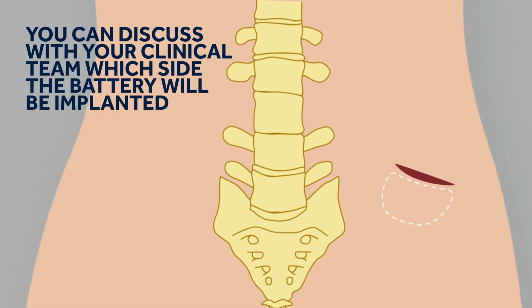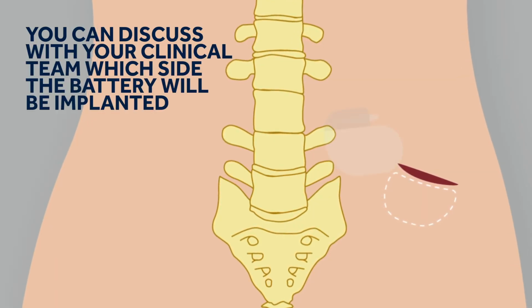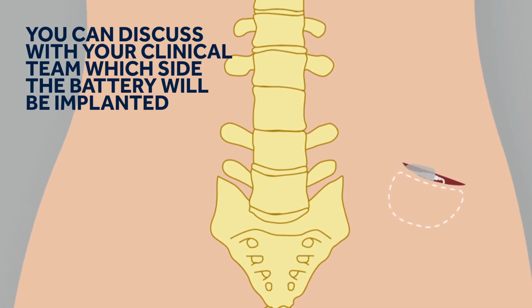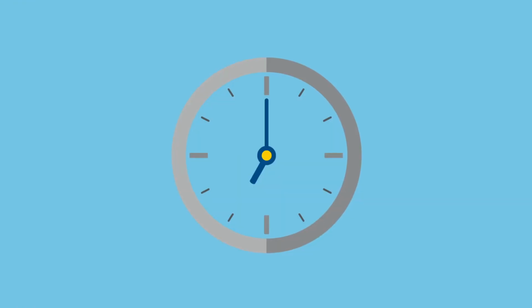The battery is the part of the system that produces the pulses of stimulation and also goes under the surface of the skin in its own little pocket in the upper buttock, where it will be most comfortable and cosmetically acceptable for you. This minimally invasive procedure may take an hour and can be done under local or general anesthesia. This will be decided with your clinical team.